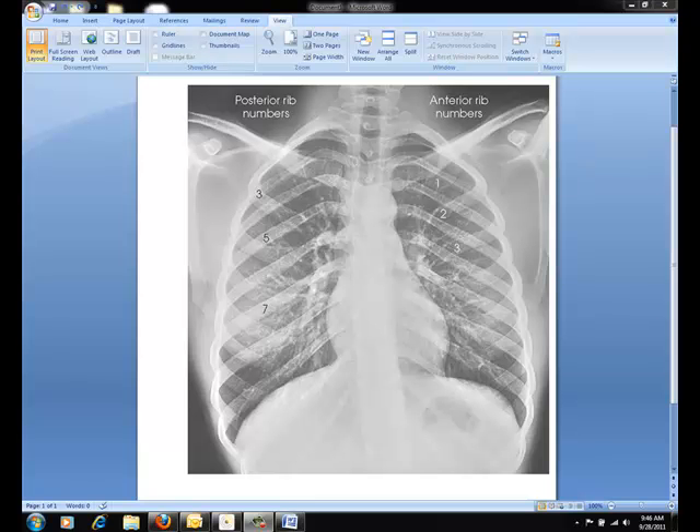As we prepare for ribs, I'd like you to refer to your iPad for the positioning and the images of the unilateral ribs. Today I have selected this image for you to review. It has a very good numbering of the ribs, both the anterior and the posterior ribs. This would be a really good image for you to practice counting ribs.